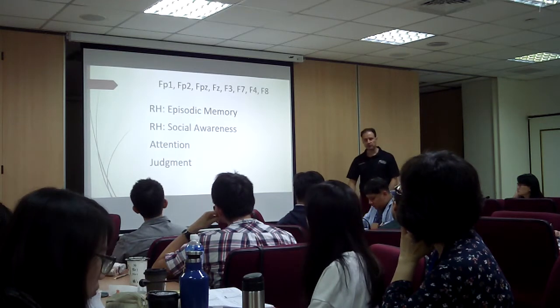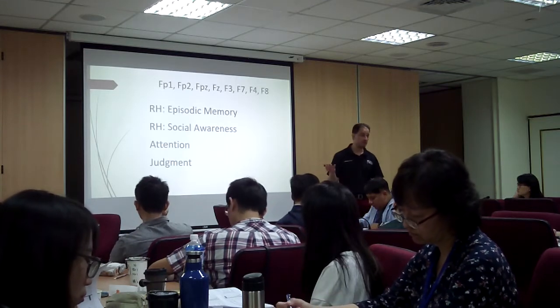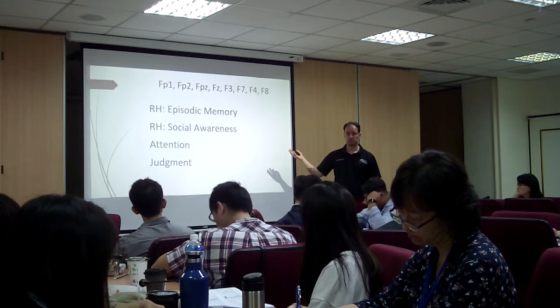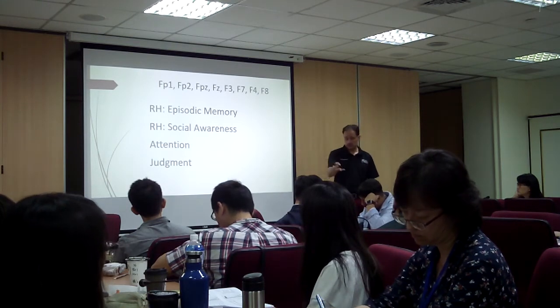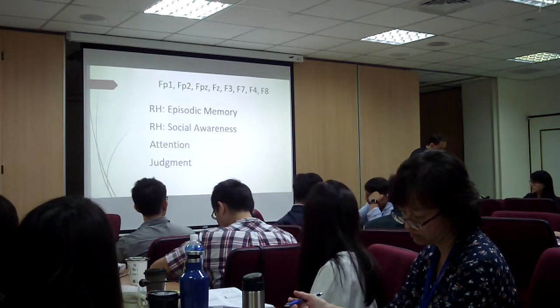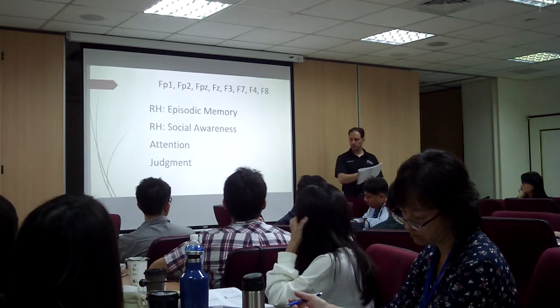In the beginning, because you don't know this, and it's hard to remember because there's a lot of information, what you do is you look at the EEG and then you refer to your material. That's perfectly fine. You go, oh, okay, there's a problem with F7. That's Brodmann area such and such. Oh, so you have problems with this and that.